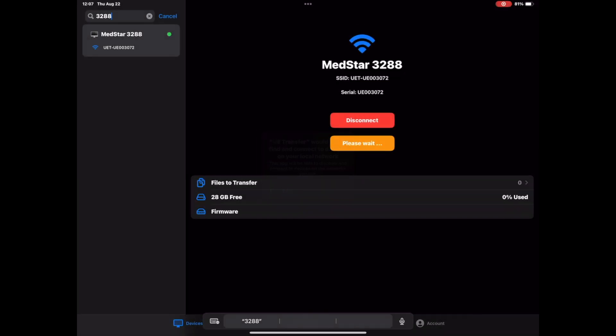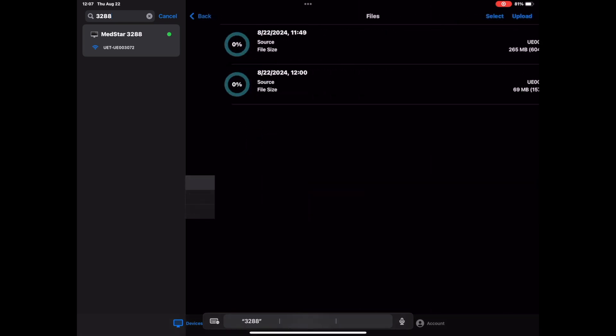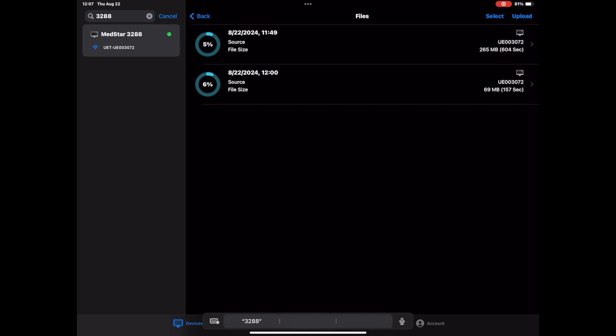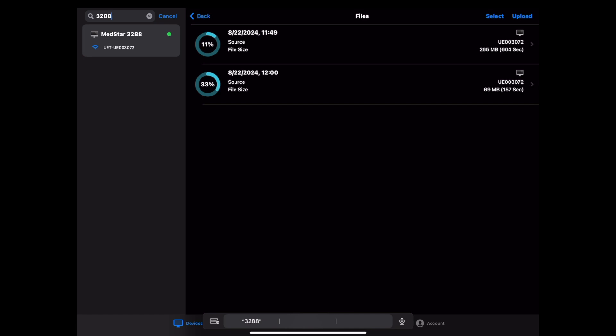Once the Wi-Fi logo turns green, your device is connected and all files on the device will automatically start uploading to the app. At that point, you can tap checkout files to track the upload progress of your file or files to the app. Depending on the number and the size of the files, this can take less than a minute or up to a couple of minutes.